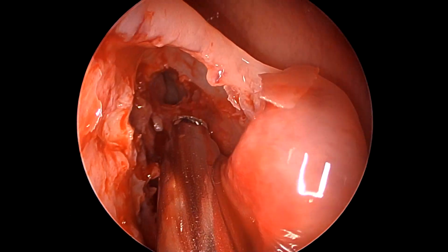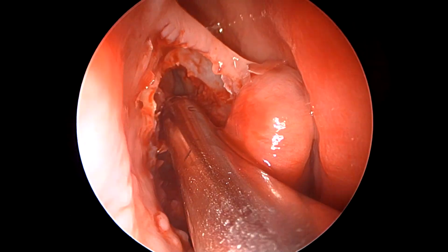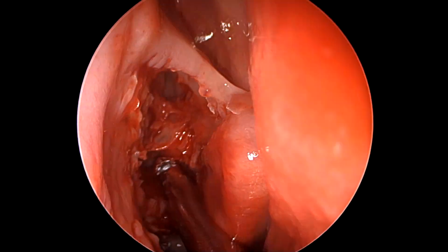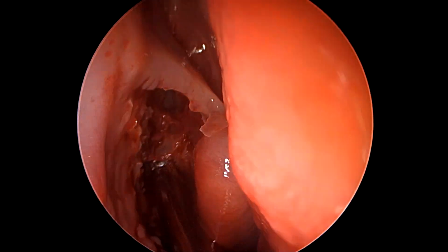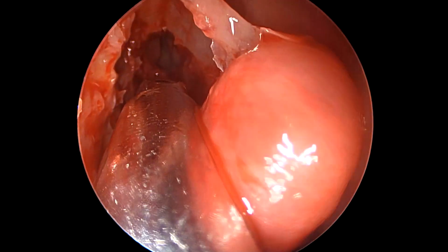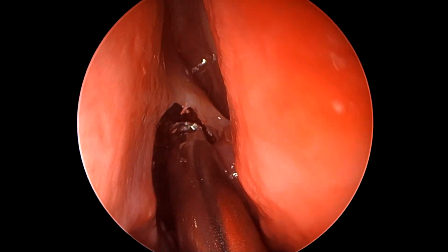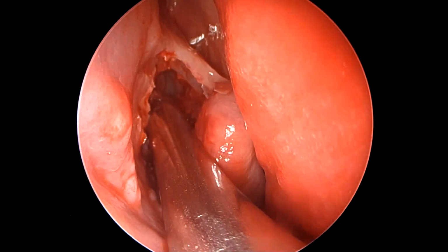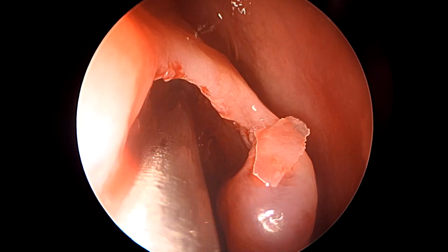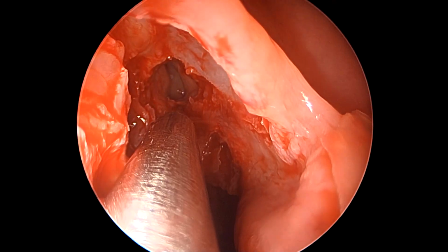So here we're using a 40-degree curved microdebrider blade to clear some leftover cells and excess tissue inside the frontal recess, while again trying to formally evaluate the anatomy as to where we are before we proceed any further. So just a simple thought: almost every fraction of a millimeter of space that we achieve anteriorly is vital for our adequate posterior vision, because if we do not have anterior vision, we certainly cannot work posteriorly.